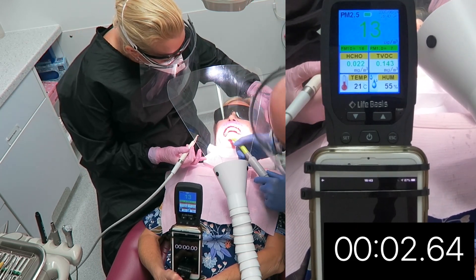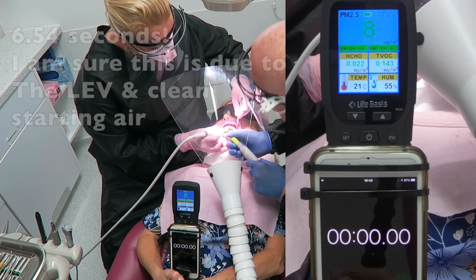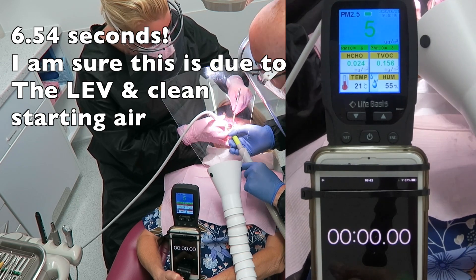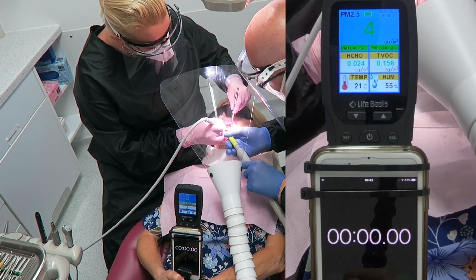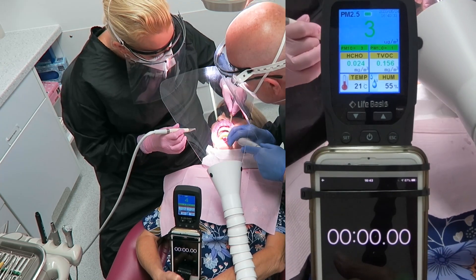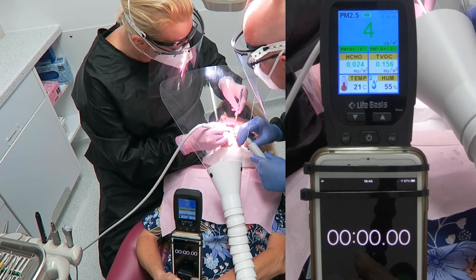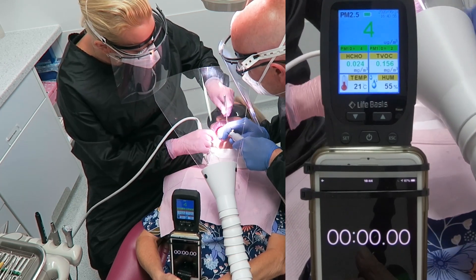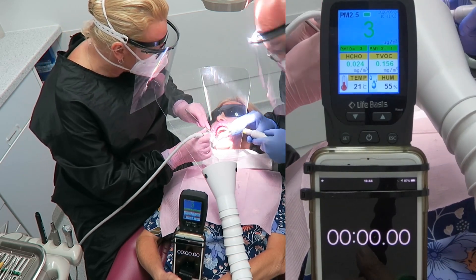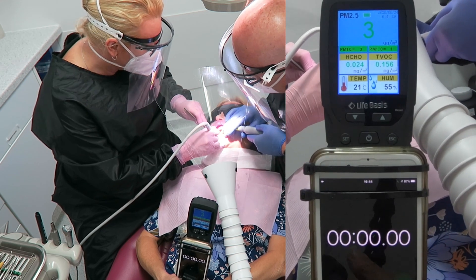I'll just get each turn towards me now. No, no readings at all, absolutely no readings at all at the moment.